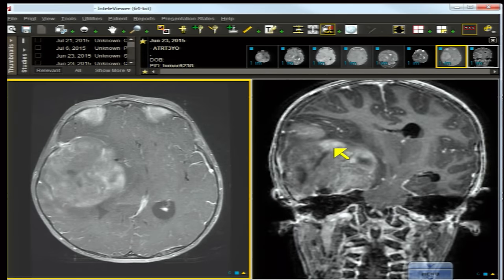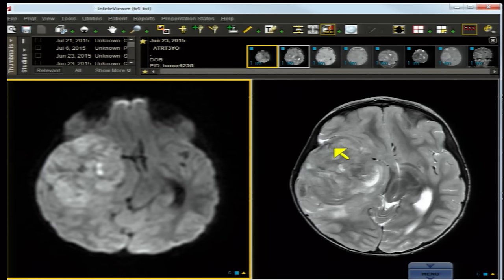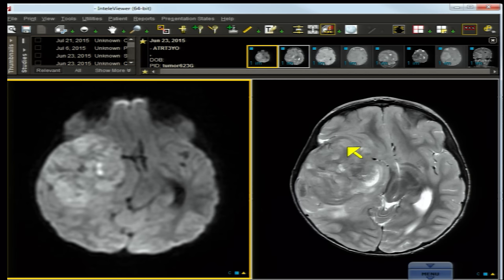Starting with the diffusion-restricted image, which shows high signal diffusion restriction — an indicator of an aggressive lesion. The axial T2 shows little evidence of cytoplasm; it's a cytoplasm-poor lesion since it's not very bright, but there are cystic foci within the lesion.